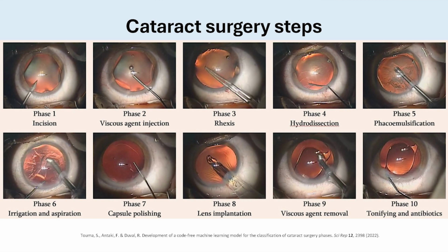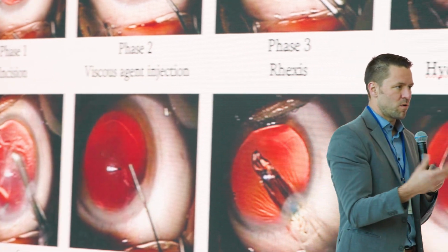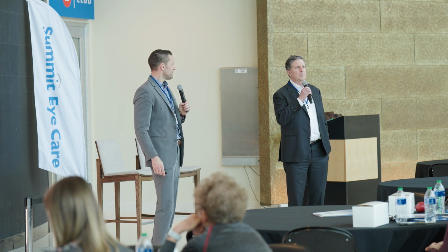Number three, probably the most delicate part of the procedure is making the capsulorhexis. We want to have a nice circular capsulotomy to work with so we can extract that lens. And that part, probably, would you also agree, is one of the more tricky parts of the procedure? It's one that we have traditionally done by hand, and we think we can get pretty good at it, but quite frankly, what couldn't be done better by a laser? And this is where we're going.